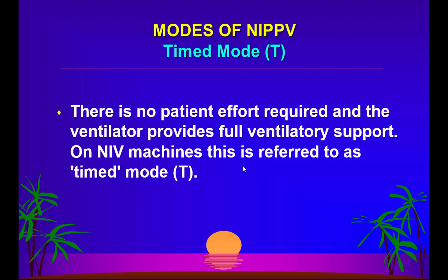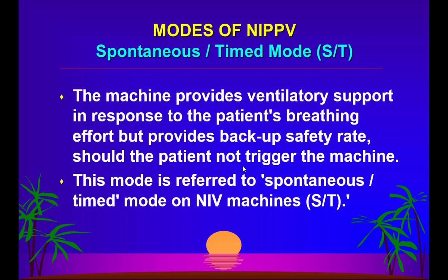Intubate them, put them on assist control, and when they are fine, maybe then wean them off on non-invasive ventilation. So what is basically NIV made for? It is made for those patients who can breathe spontaneously, adequately, appropriately, a little bit, right? Not the patients who will require timed breaths, or who are hypoventilating so much that they cannot trigger the ventilator. That is very, very important.